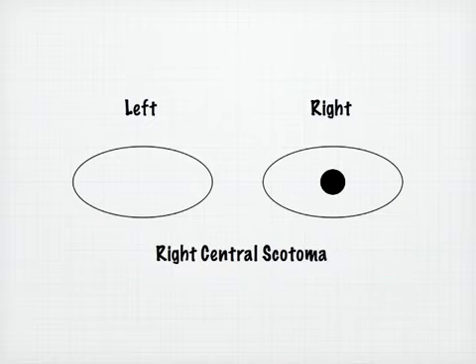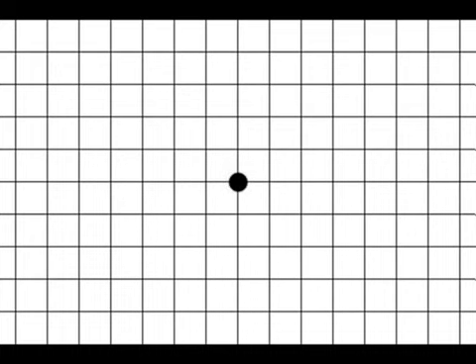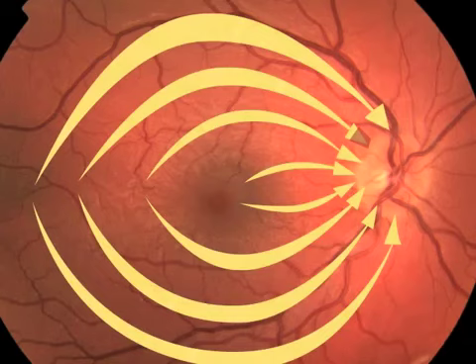macular degeneration or AMD. An Amsler grid is a simple 5mm grid pattern where the patient attempts to fix at the central dot from about 30 cm with each eye in turn. These can be useful to identify and monitor central scotoma. A new or changing central scotoma, or indeed distortion of central vision, may indicate treatable wet AMD, and should be seen promptly by an eye specialist.